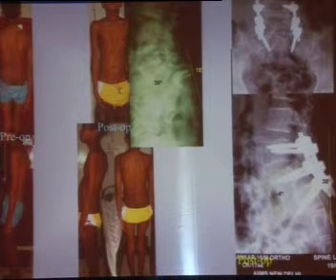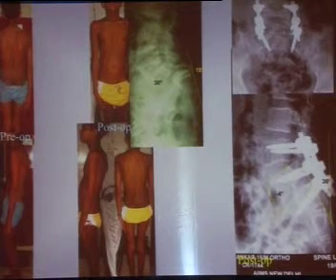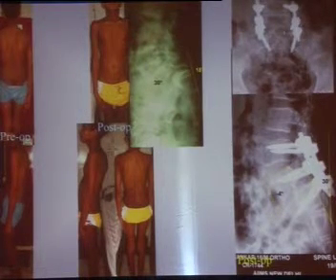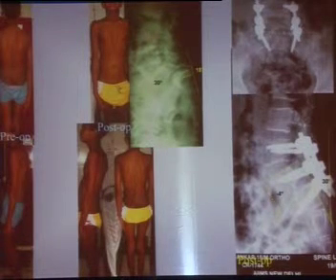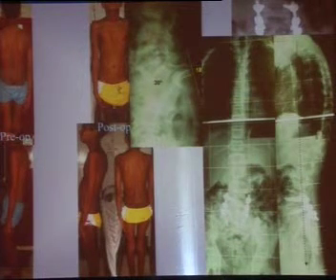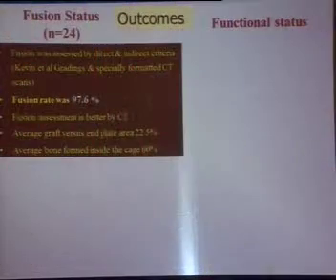Now, the ones where the spine is relatively balanced, but the pelvis is not, by just doing it from the back and mobilizing it all around and instrumenting it, even if you have got a partial correction, you'll be able to correct and align and restore the balance there, reducing the sacral slope, reducing the pelvic tilt. Your pelvic incidence would be the same, and you'll get a fairly decent result like that. And you see that the crouch gait here, even if they haven't achieved a complete correction, is totally relieved, and the patient, of course, does well.